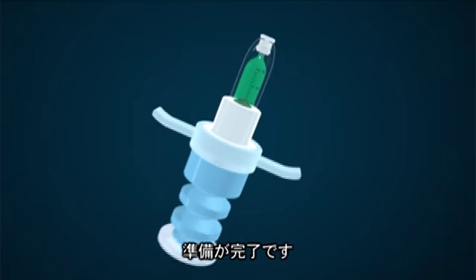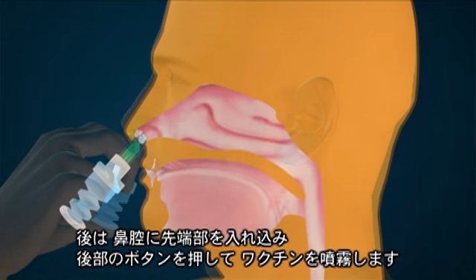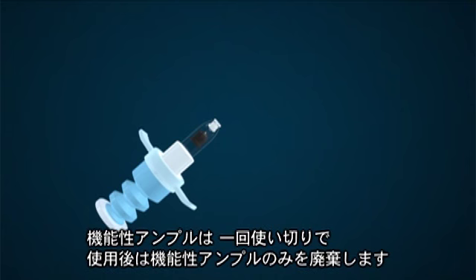Set this in the casing. Press down on the tip of the ampule. This completes the preparation. Next, place the tip of the device into the nasal cavity and spray the vaccine by pressing the button on the bottom. The vaccine spray reaches the mucous membranes deep within the nasal cavity, allowing the effects of the vaccine to be fully exhibited. The ampule is one use only, and the ampule alone is discarded after use.